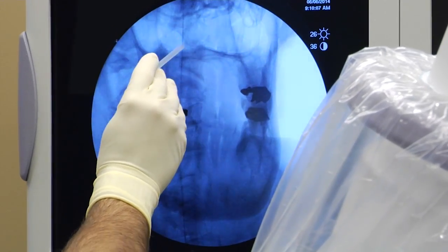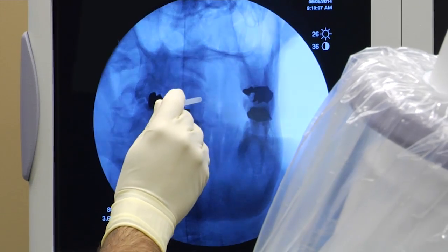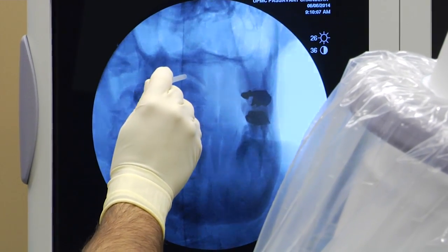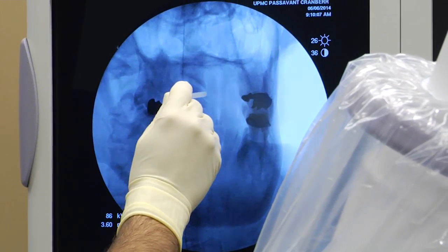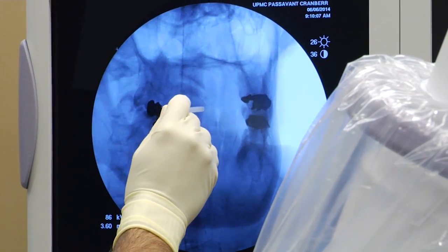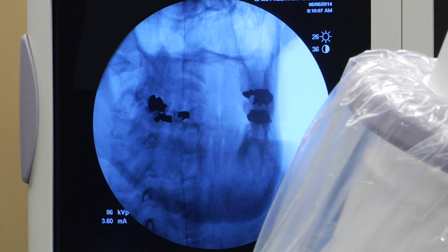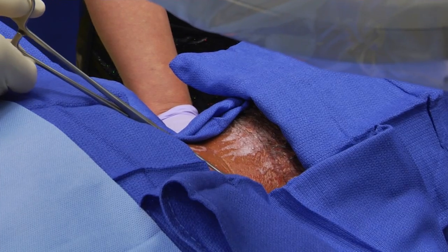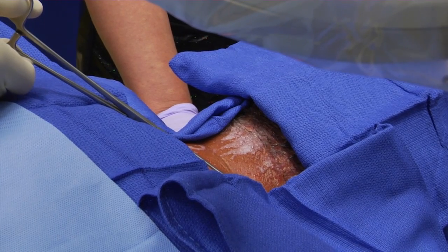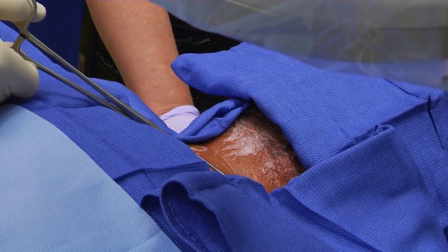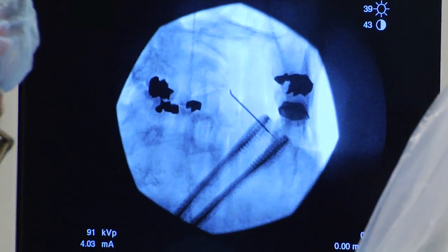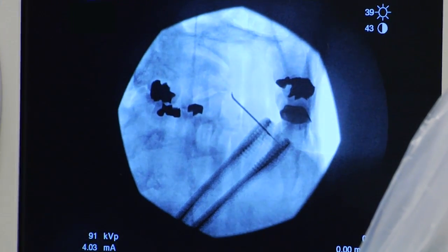The initial starting position lies immediately lateral to the C2 and C3 facet joint line on the trajectory view. This trajectory will allow us to position the needle parallel to the third occipital nerve.